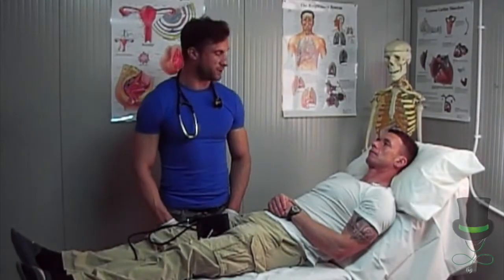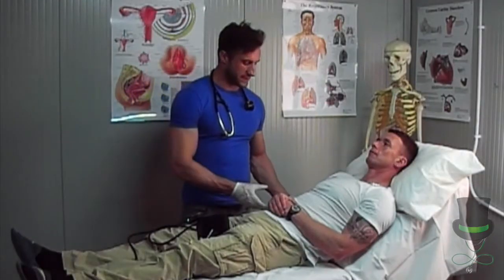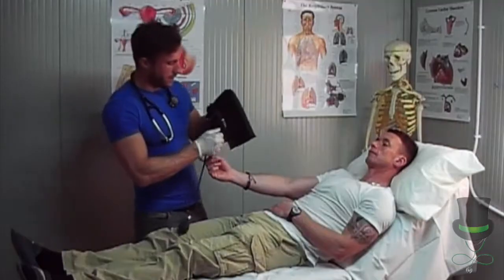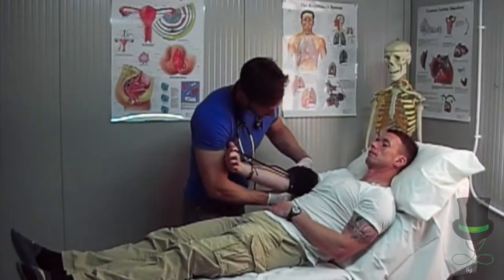Hello, I'm Frank and today we're going to do your blood pressure by auscultation. First of all, get the patient to extend his right arm and apply the blood pressure cuff, aligning the arterial guide with the patient's brachial artery.